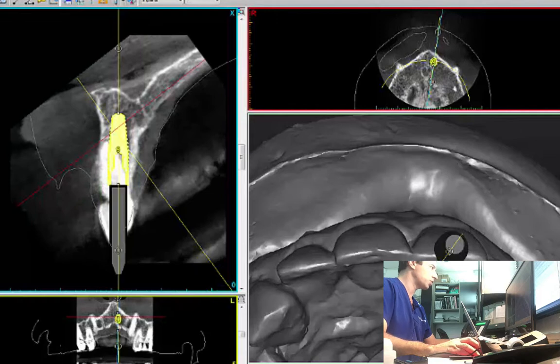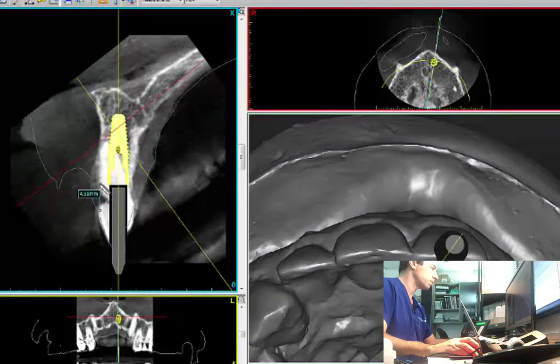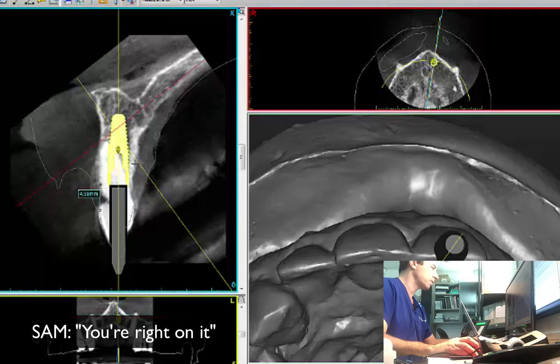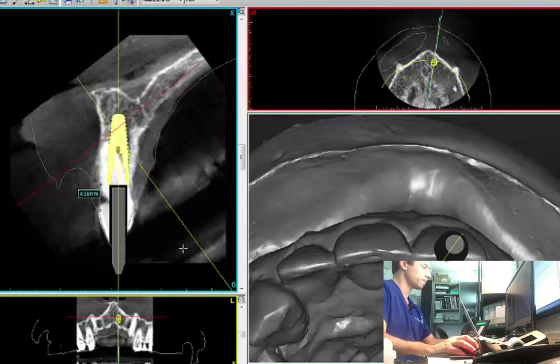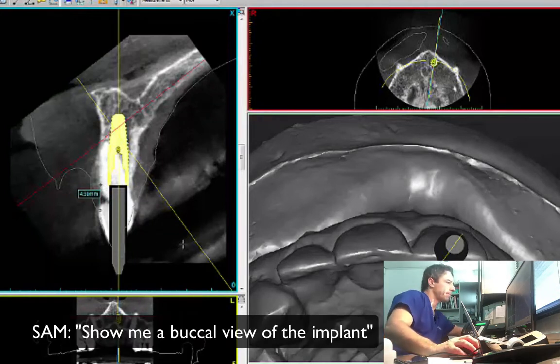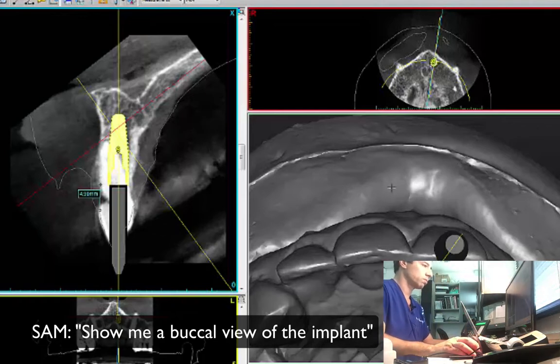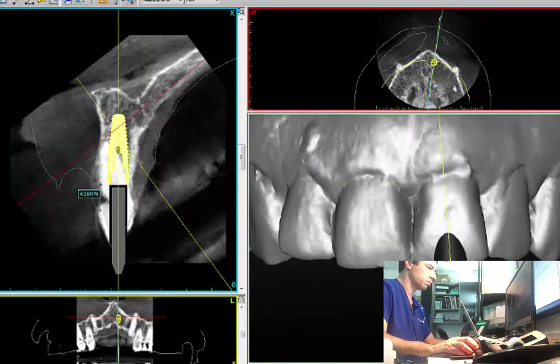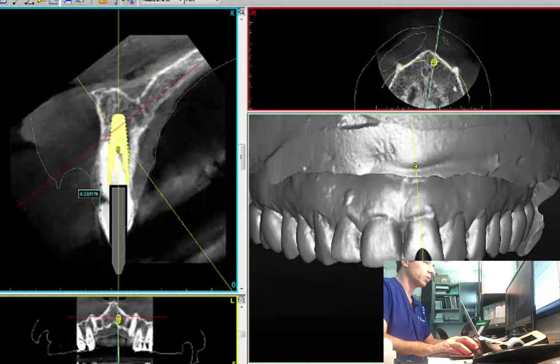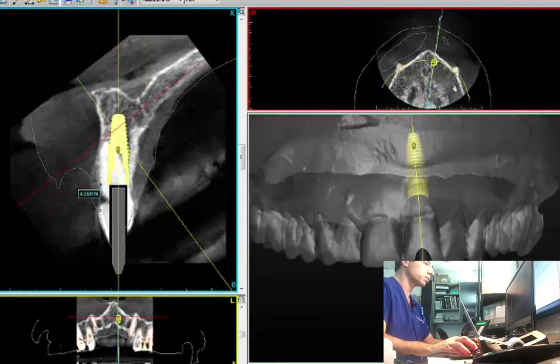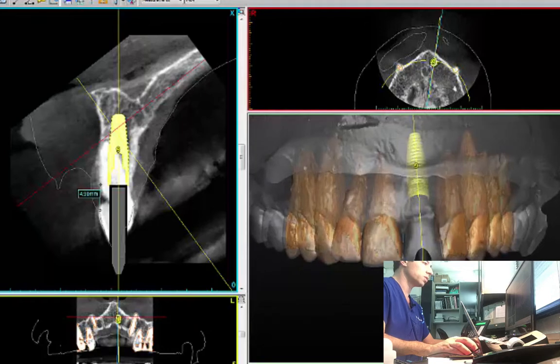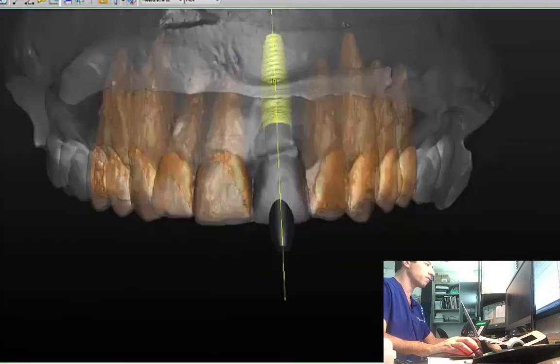Let me make a measurement. Let me measure five and then we can sync it exactly to this level. 4.9 — you're right on it. We're right there. Perfect. Now show me a buccal view of the implant on the image. I can show you the transparency with the roots. So you see how the roots are positioned. Let me make a bigger view of this.